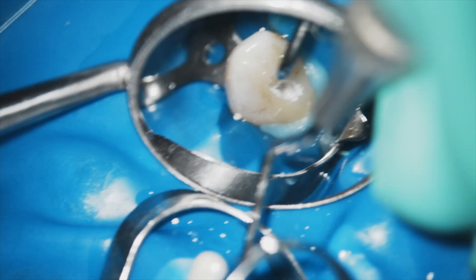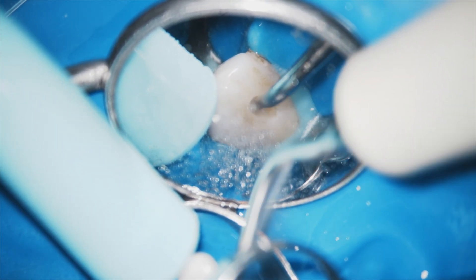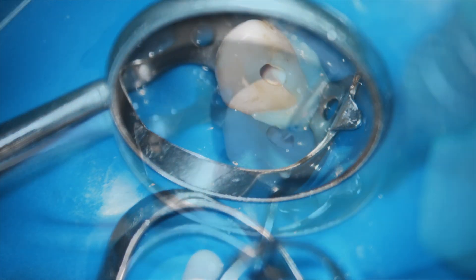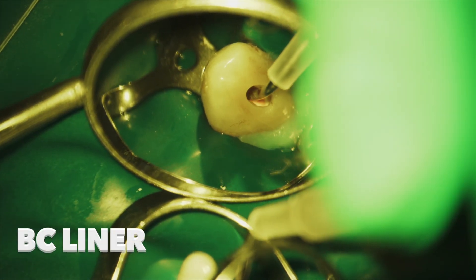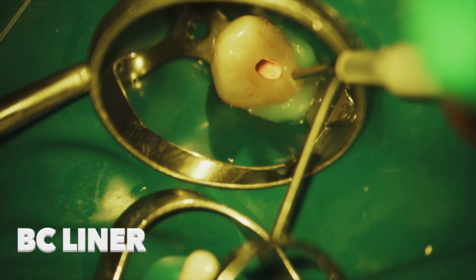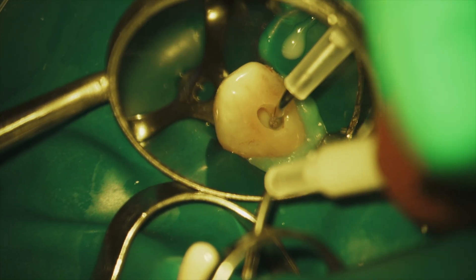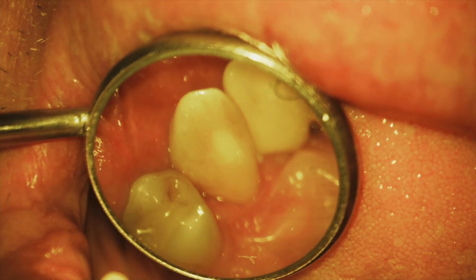The two 25/06 cones alongside the main 45/04 cone allow a really nice completion of the obturation of this oval canal. The Total Vac can then be used to suction out the fluid. Now we go straight with the BC liner to fill up the rest. It's important to bleed the syringe and dispense a little at the beginning of the mix so that the poorly mixed portion of the material is not expressed first. You can then fill all the way back up into the tooth, and I use the Woodson to pull the BC liner toward the margins.